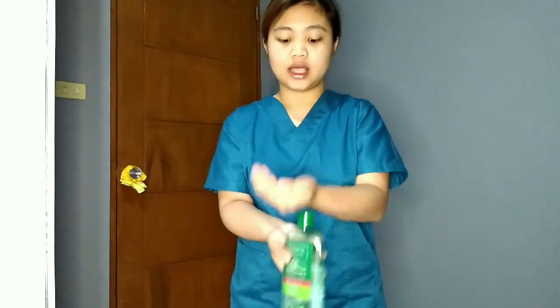And also don't forget to check the appropriate height or fit of cane, crutches, and walker. And of course, ensure that your ambulation device has rubber tips. Before applying the procedure, don't forget to wash your hands, and assume that I already washed my hands so that I can sanitize myself using this alcohol. And then you can also sanitize the ambulation devices for safety purposes. After doing the hand hygiene, always ask your patient to report any tingling or numbness in upper torso.